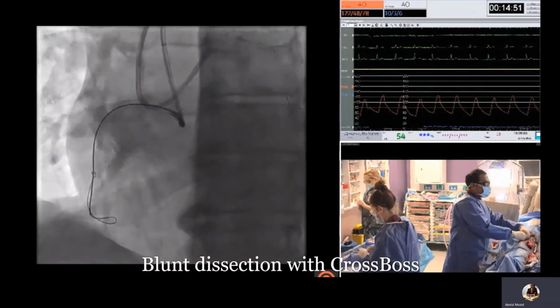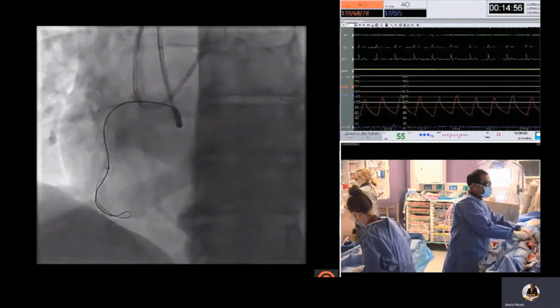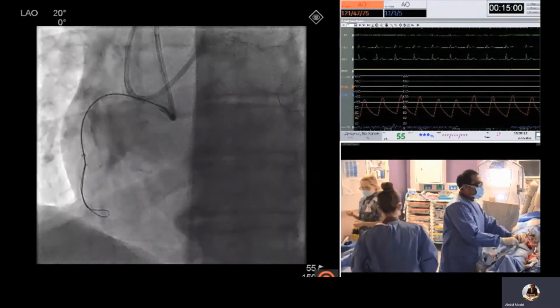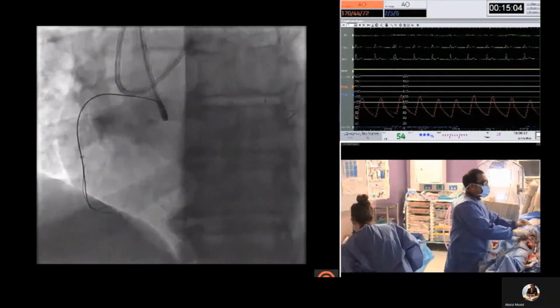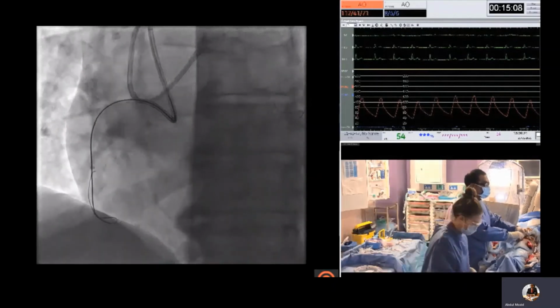And if you look at the hemodynamic monitoring, there is no pressure trace, which is the blue line from the right coronary artery, and this is because the Trapliner is well into the vessel and damping the pressure trace.